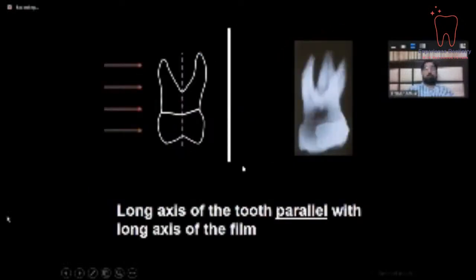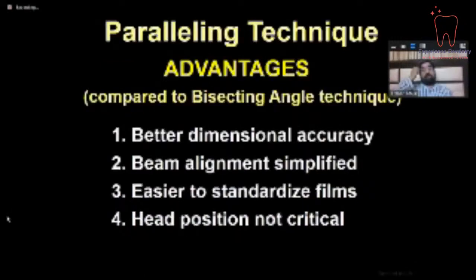In this technique, the tooth, the film, and the X-rays come in one line, and they produce the image where the tooth is parallel to the long axis of the film, and that is the true image of the tooth. For that purpose, what we see here is better dimensional accuracy. Beam alignment is simplified. You do not have to adjust anything, as this device standardizes the film. Further, in your postgraduate study, you can apply it. And head position is not critical. You can place it anywhere with the help of the device.